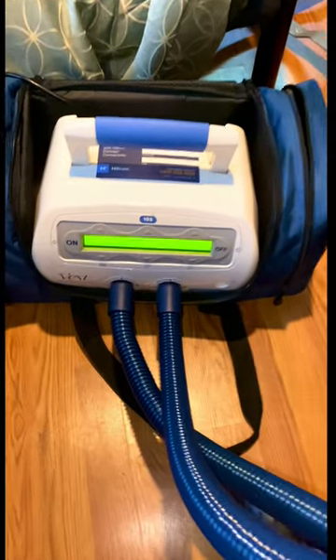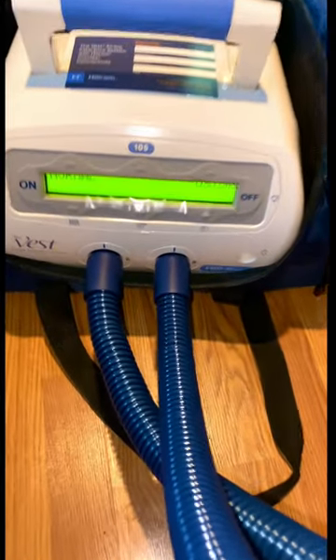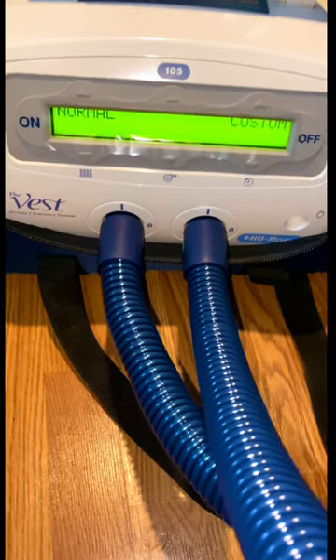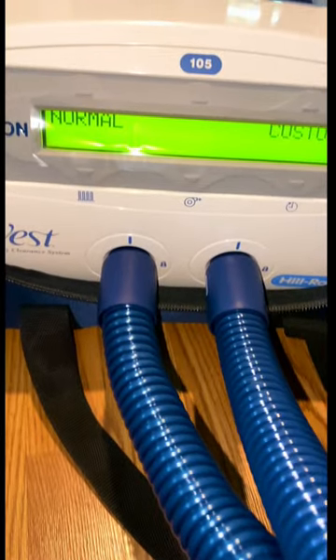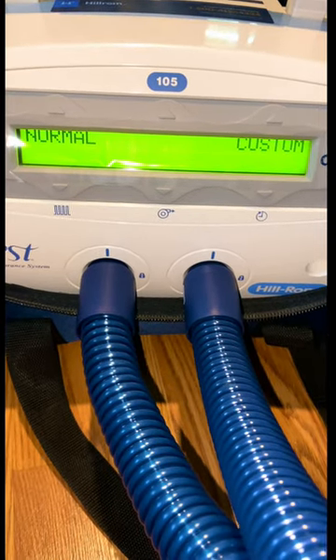Hey y'all, we're gonna go over some of Trevon's therapies. Today we're gonna focus in on the Shake Vest by Hill-Rom. This is a phenomenal product. It has modes — normal and custom.